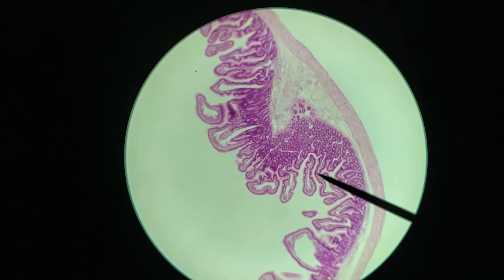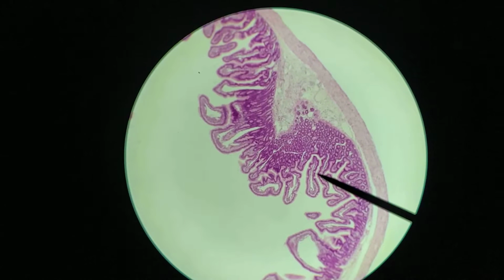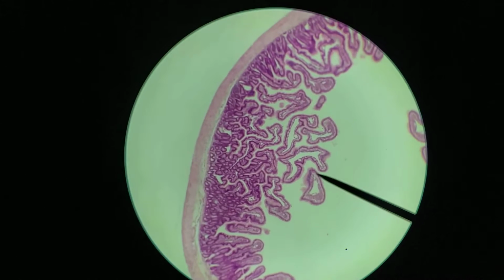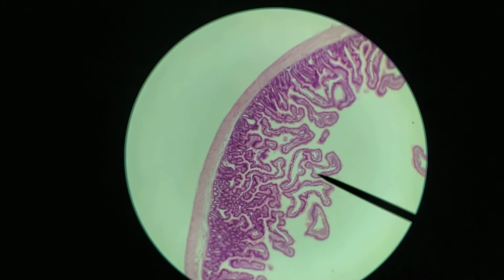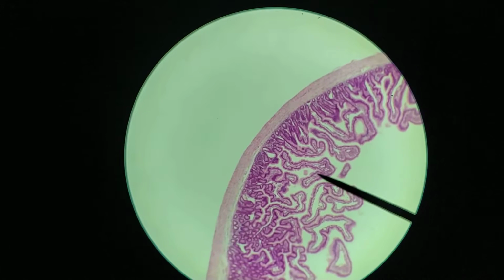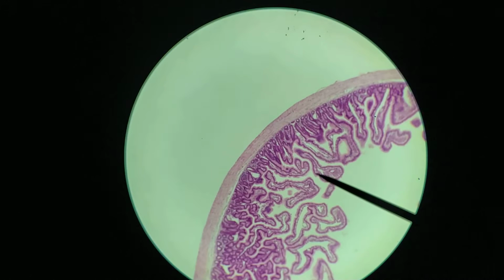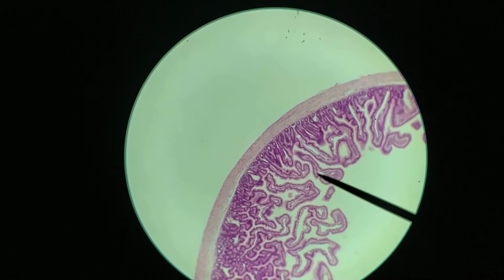We have fairly prominent villi here, and they're actually fairly elaborate as well. So one of the things we tend to see in the jejunum is that we see the kind of detached looking villi. That's just because we're looking at a three-dimensional structure in 2 dimensions. So these villi tend to branch off and be very elaborate to really increase the surface area. And so what we tend to find when we cut them in cross-section is some of them look very detached, and that's what you're seeing here.